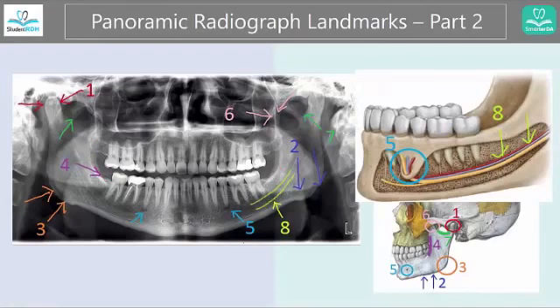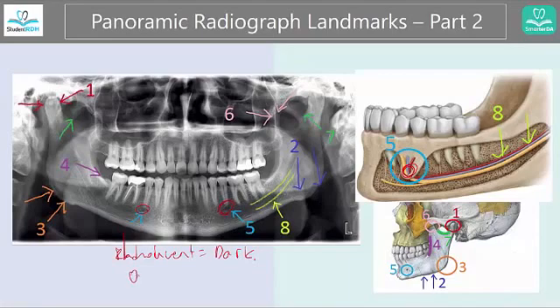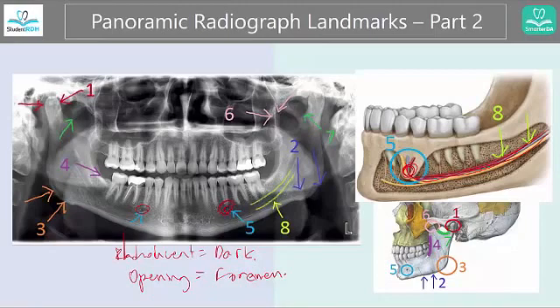Number five — I brought this special image because I want you to first see this. Are those little dots a little more radiolucent, meaning dark? Yes, they are, because those are openings — we also call them foramina — and those are where the veins, blood vessels, and nerves come out of. Those areas are usually below the premolars, between the first and second premolar, or just below the second premolar, depending on the person's anatomy. You can see those two areas are darker.